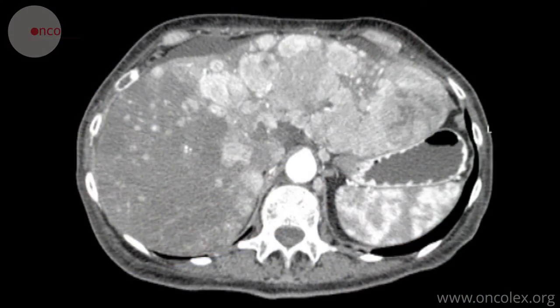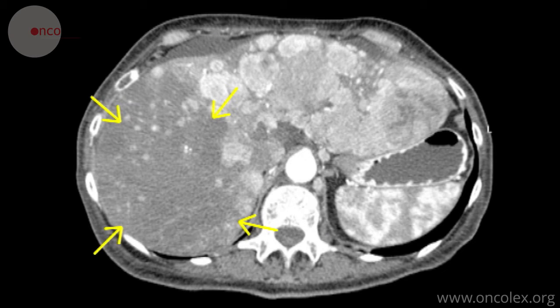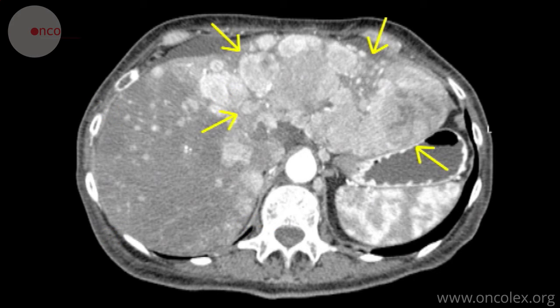This CT scan, taken six months after embolization, shows that the metastatic tumors in the right lobe have significantly decreased in size. In the left lobe, which was not embolized, the tumor volume has increased.